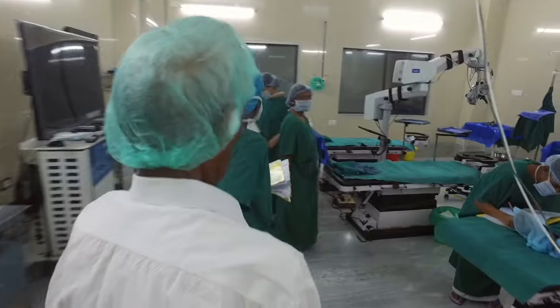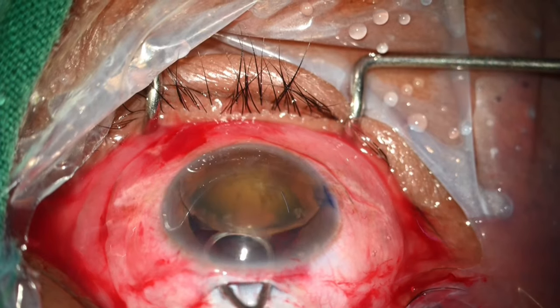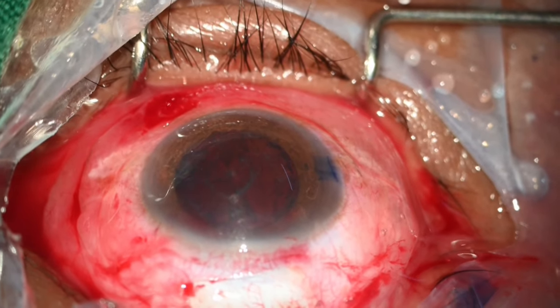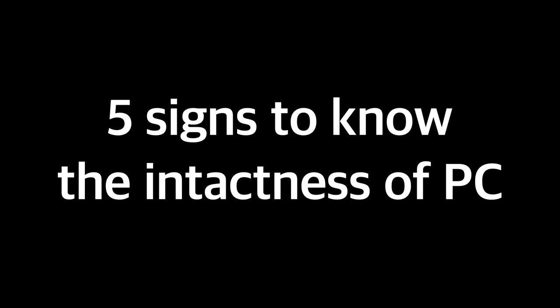Welcome to the world of cataract surgery, where precision and attention to detail are key. For beginners or novice surgeons, recognizing the posterior capsule during manual small incision cataract surgery can be a daunting task. But fear not, we have got you covered. In this video, we will demonstrate the 5 signs to know the intactness of the posterior capsule before intraocular lens implantation.